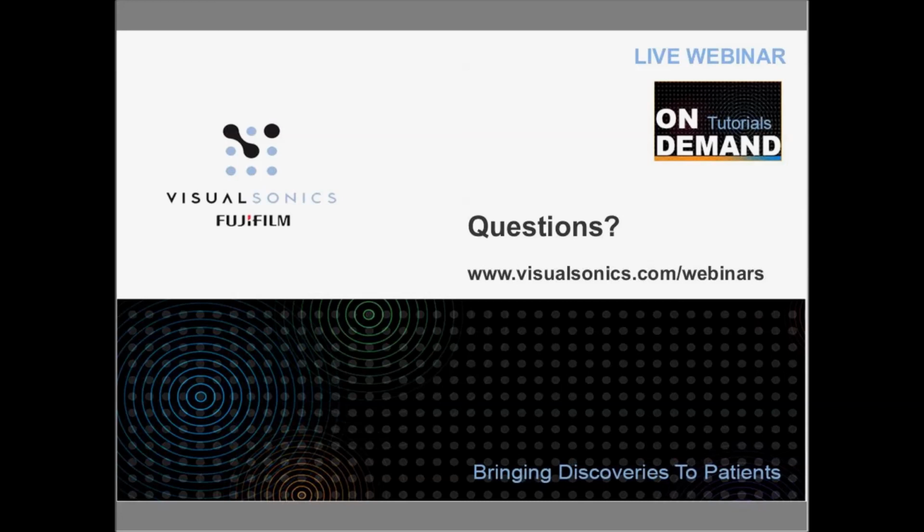The other question is with regards to good heart rate or good ECG tracing, for a mouse with a heart rate of 500, what frame rate would you recommend? Especially if you want to do both strain rate or strain measurements and then systolic and diastolic strain rate. What is your recommendation? We're going into VevoStrain, the higher you can get the frame rate, the better.